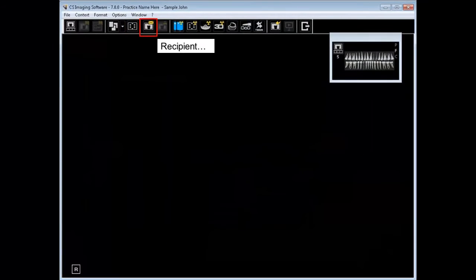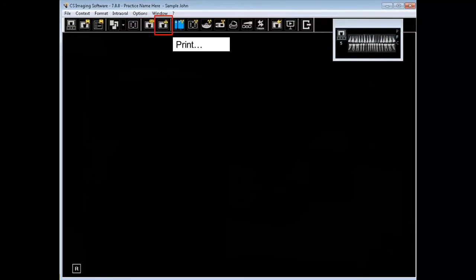Recipient allows you to email and it is covered in detail in another recording called emailing images. Printing.